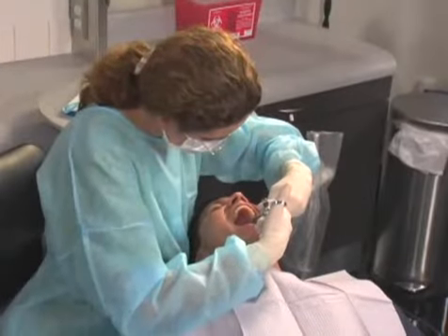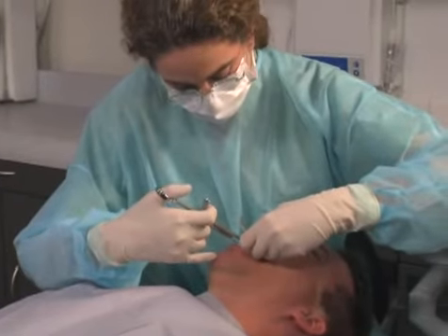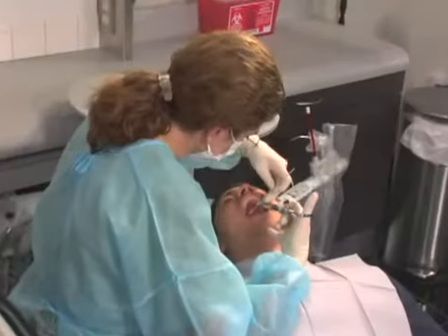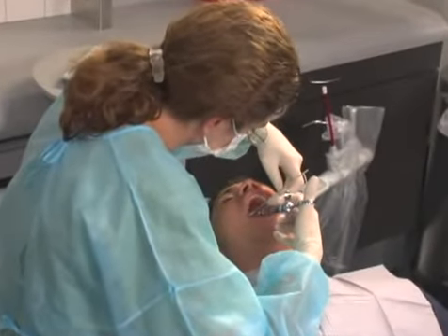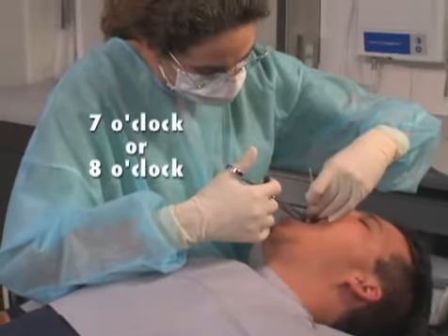For the left greater palatine nerve block, the right-handed operator should sit facing in the same direction as the patient at the 11 o'clock position. For the right greater palatine nerve block, a right-handed operator should sit facing the patient at the 7 or 8 o'clock position.